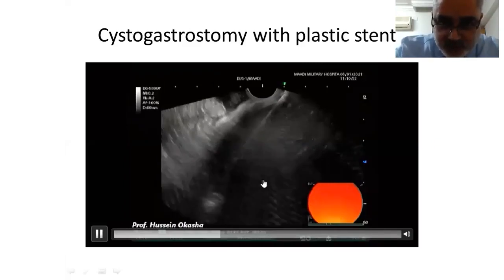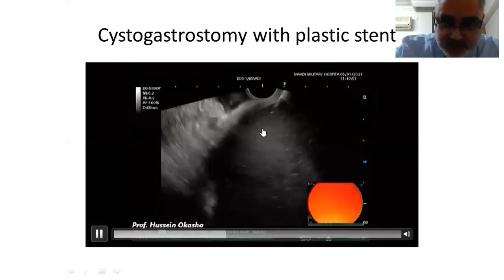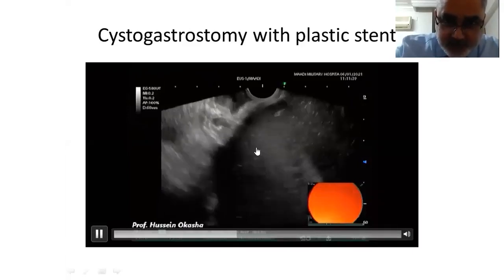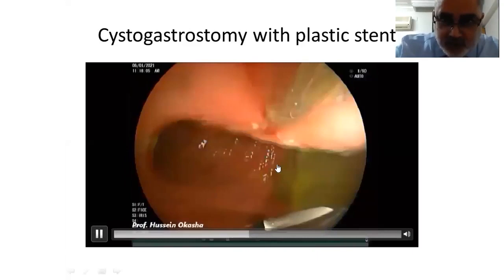Then we should apply electrocautery. This haziness of the screen means the electrocautery. And then the 6 French cystotome with ringed tip, ringed knife, pierced and widened the puncture produced by the needle. And here is introduced the CRE balloon to produce more dilatation.